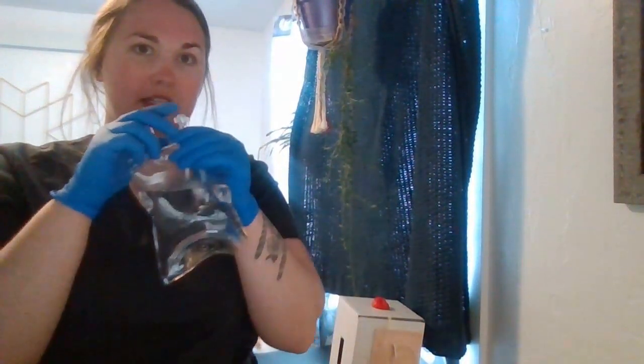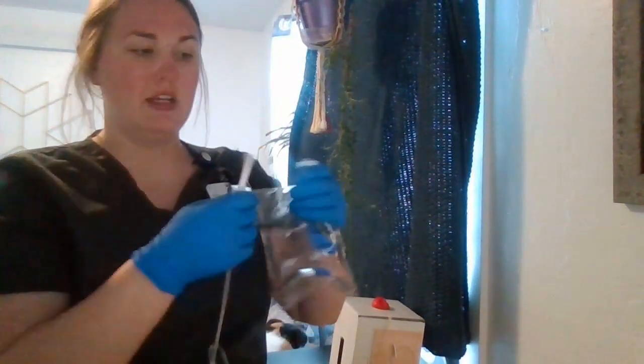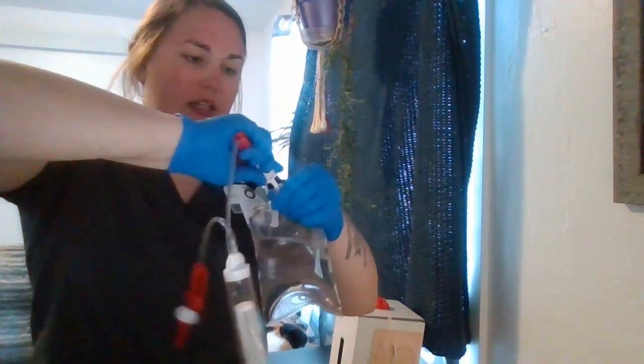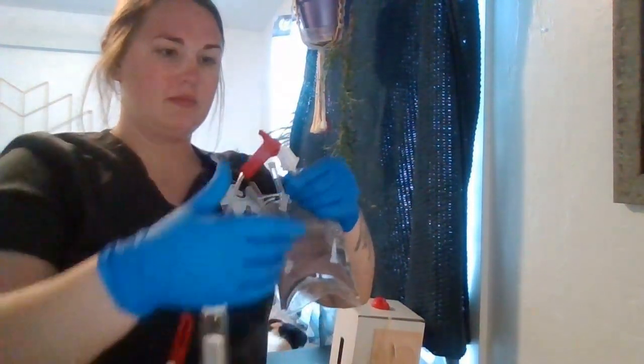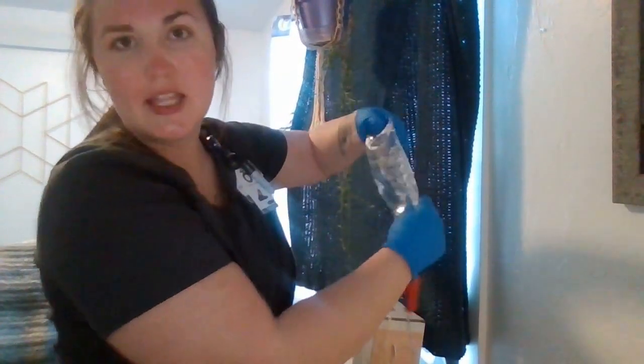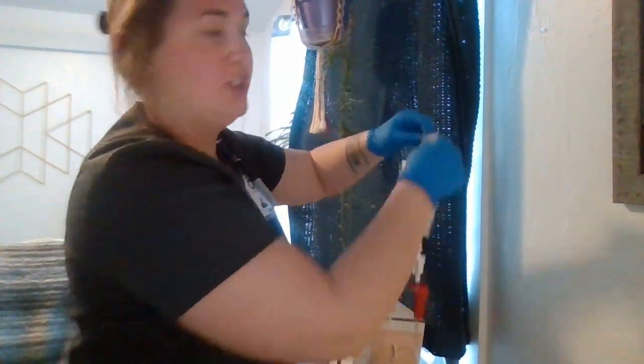I'm going to get my normal saline and I'm going to spike it using aseptic technique. I'm going to take my cap off and spike my bag, making sure all my clamps are shut. I'm going to hang this on an IV pole that is at least 39 inches above the patient.